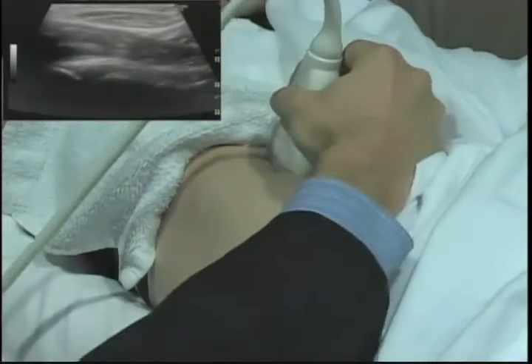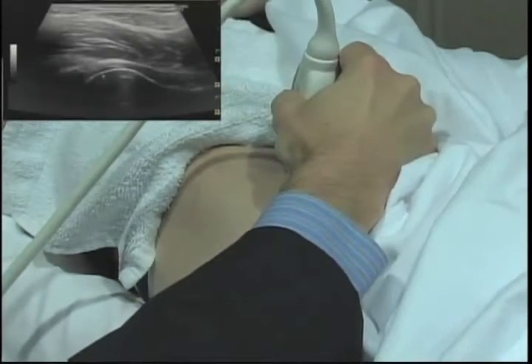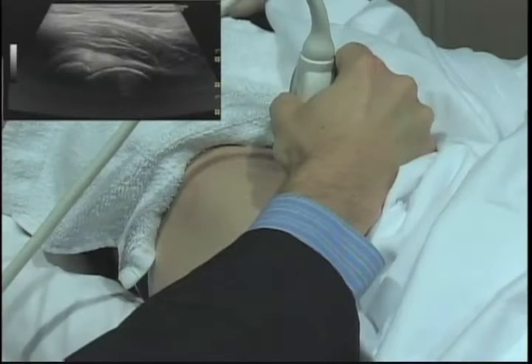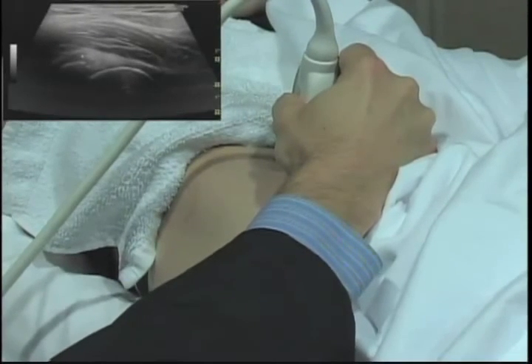And the bony landmark that we use here is the femoral head. You can see the femoral head, the hyaline cartilage, the acetabulum. Here's the fibrocartilage labrum. This structure here is the joint capsule and part of the iliopsoas tendon.